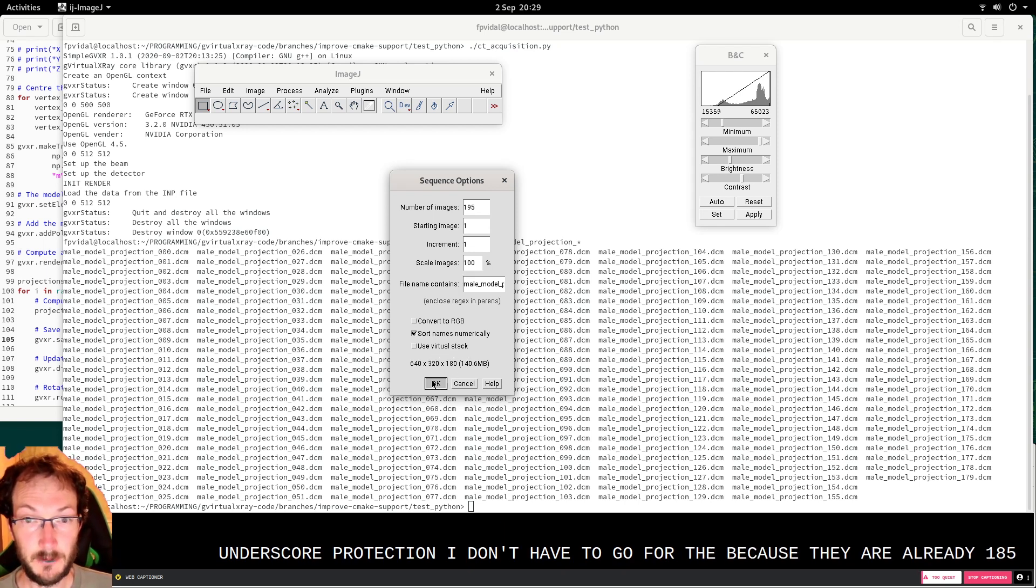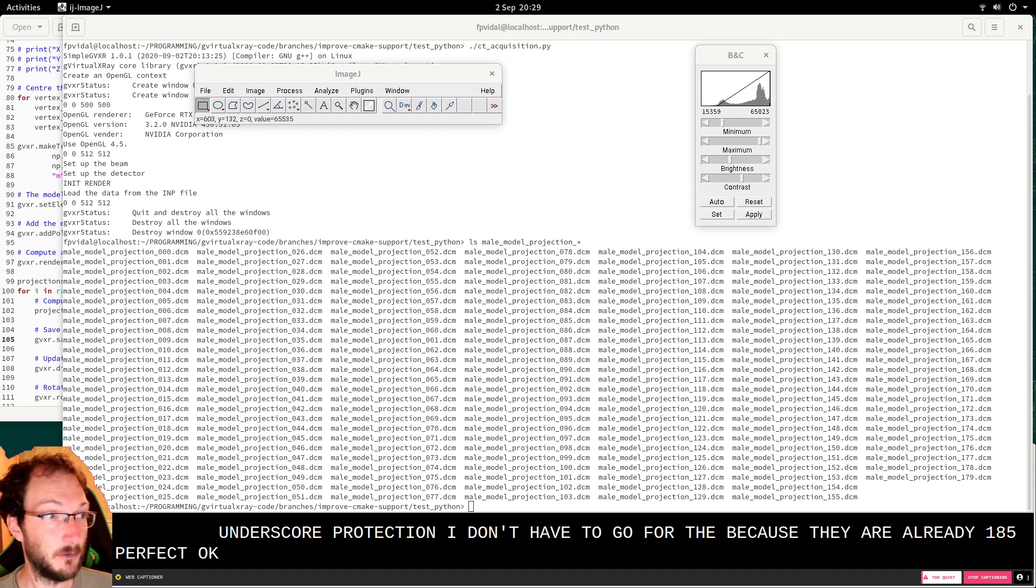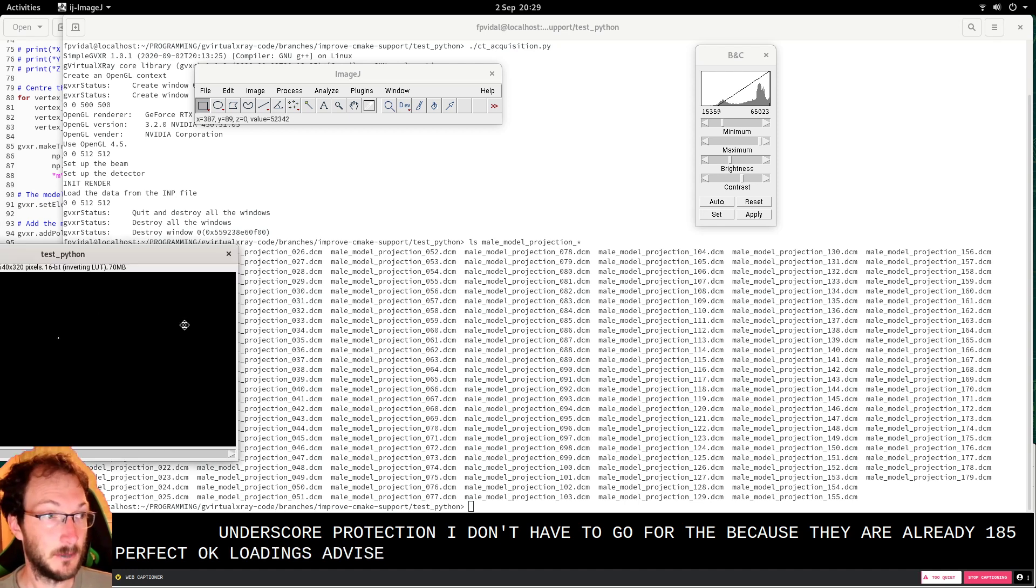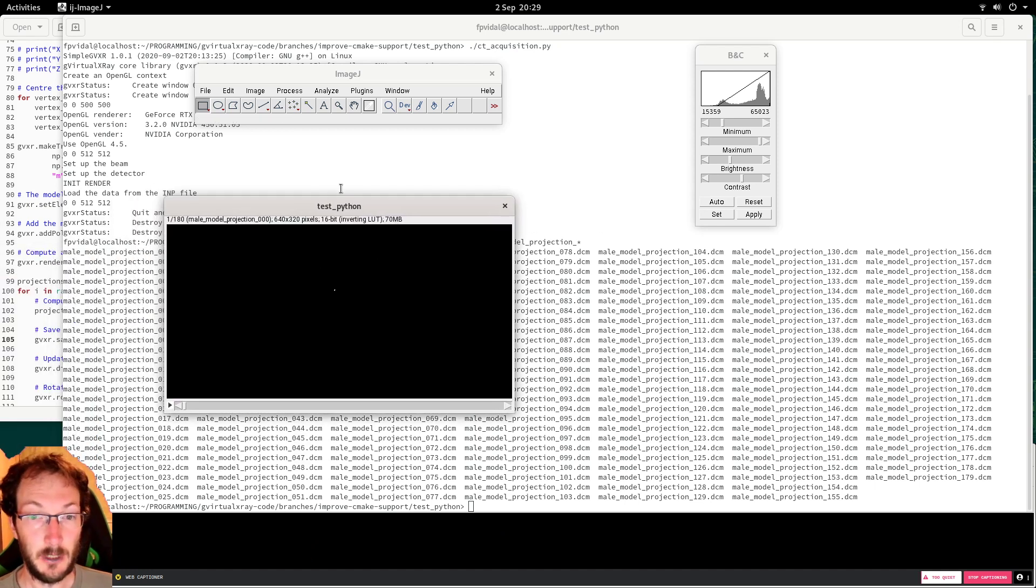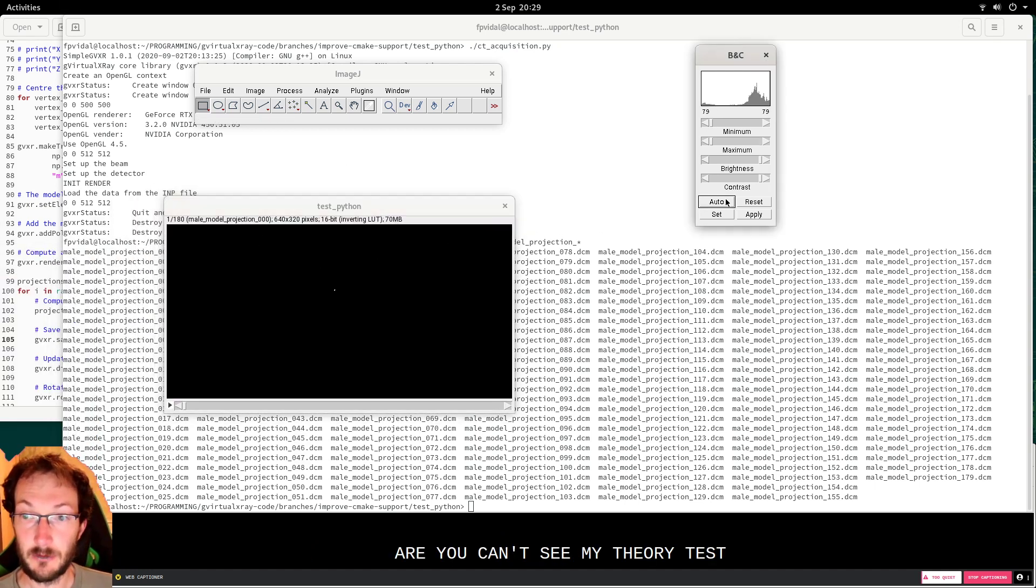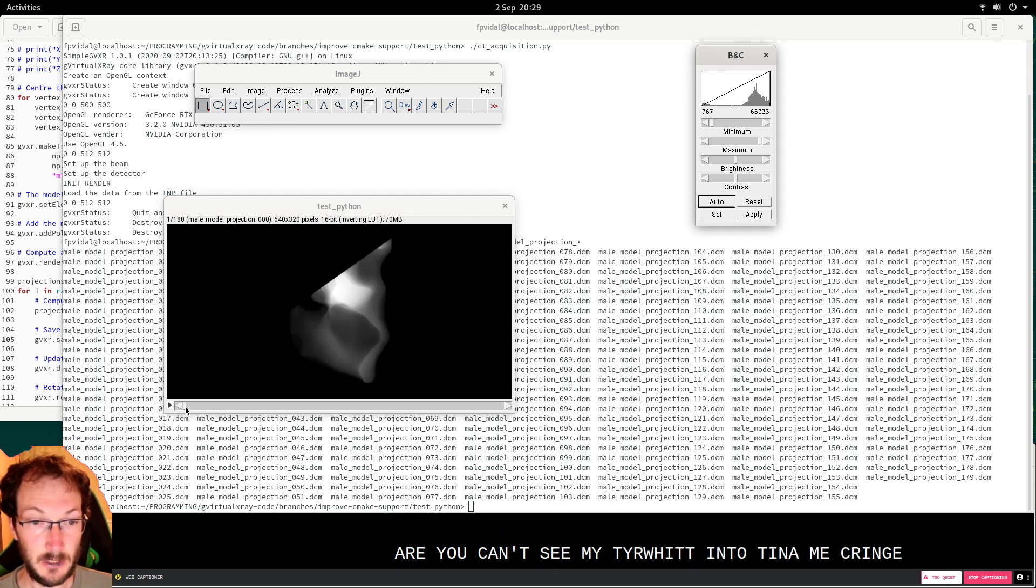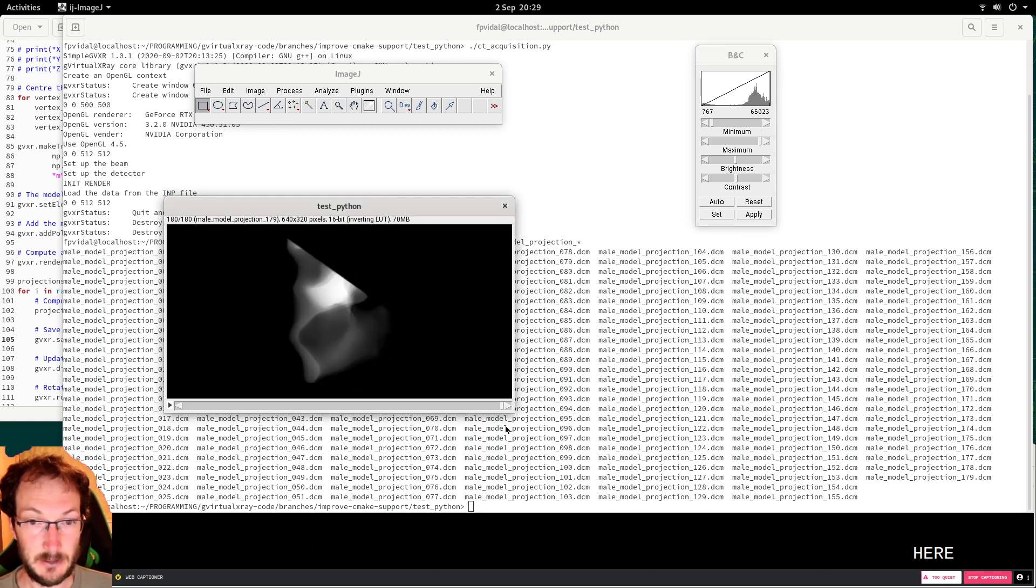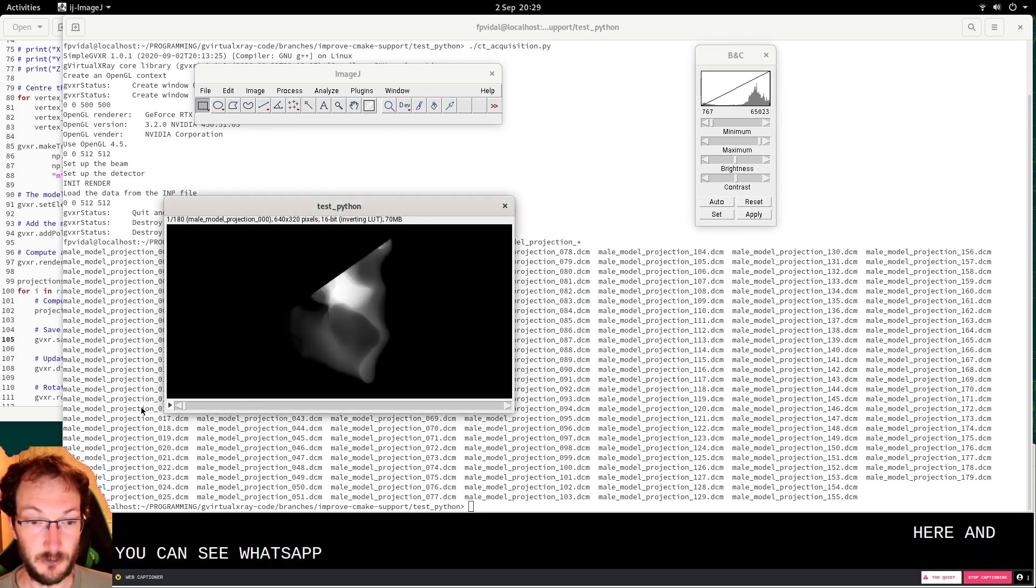OK, loading the files. You can't see much here within the dynamic range. Here. And you can see the projections.